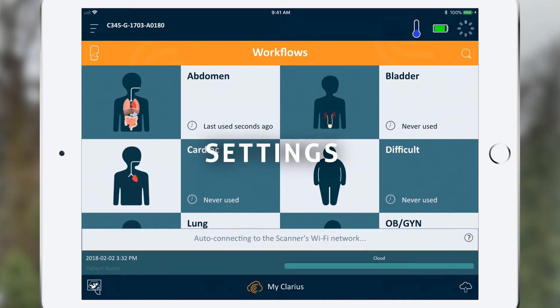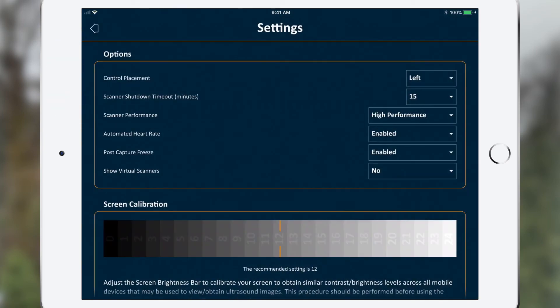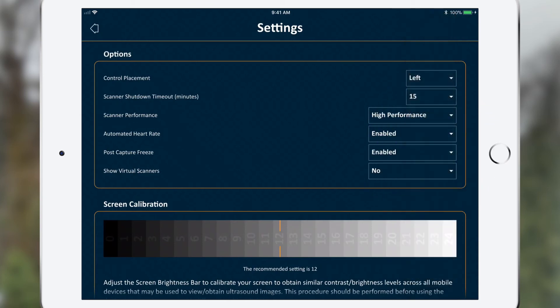You can customize a number of app and scanner functions under the settings tab on the top left of the screen. Scanner shutdown can be set from never up to 120 minutes. Our default is short to minimize battery use. By adjusting the scanner performance setting from high performance to power savings, you will extend battery life and scanning time. However, you will have slightly slower frame rates during scanning.